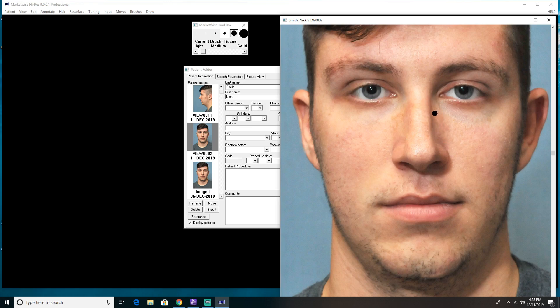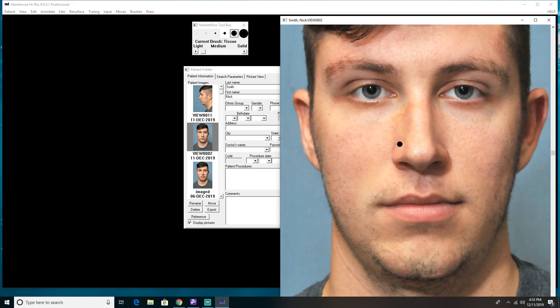Now I'm going to click out in this light area and drag the light color into that shadow so it's not quite so strong and harsh looking. There is also a little bit of a wide shadow here outside the dorsum — I often will soften those, as it distracts from showing the shape of the nose that I'm imaging. It's also a good idea to make changes to this area if the doctor is performing osteotomies. Let's do that on both sides, and kind of soften that wide-feeling area.